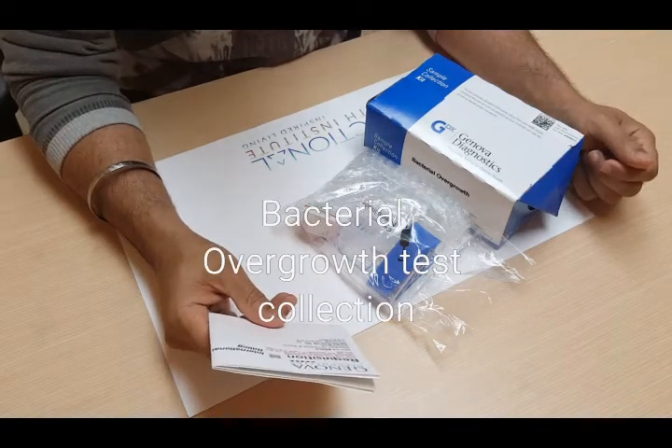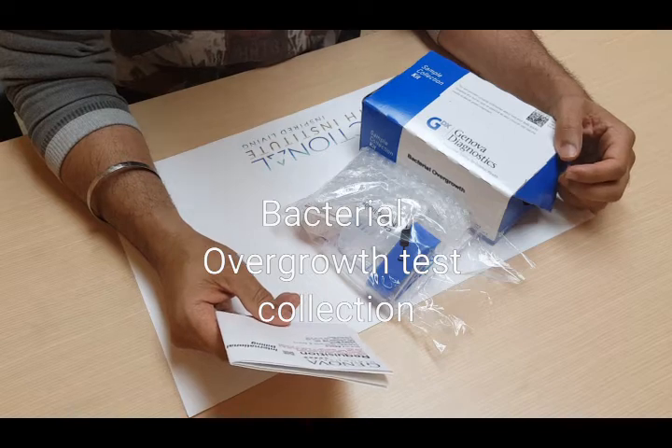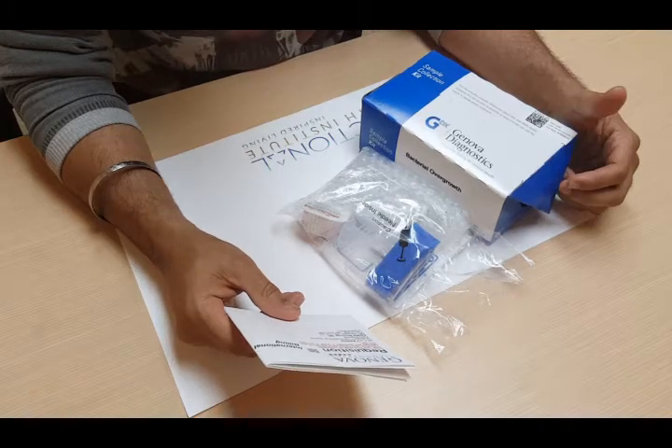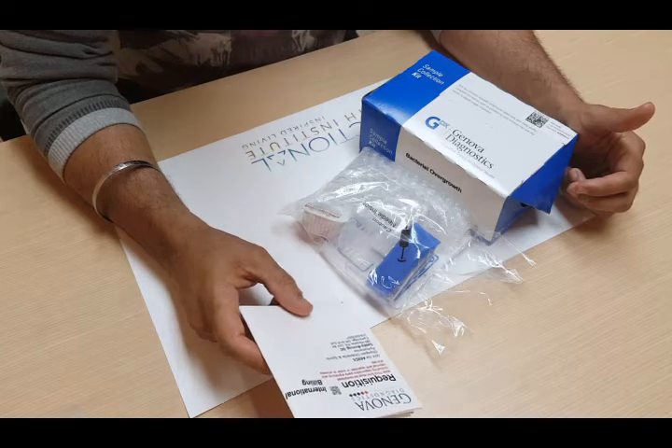This is Dr. Binning, just giving you a quick instructional video on how to do a bacterial overgrowth sample collection. This test can be a little bit confusing, so I hope this video makes this collection a little bit easier.